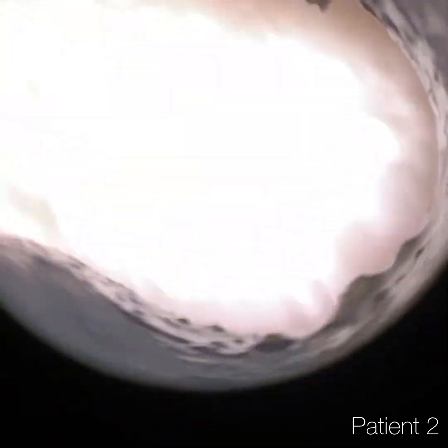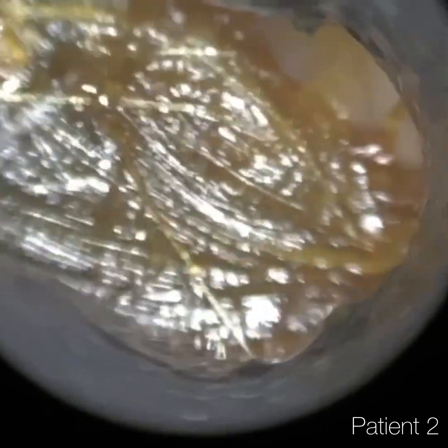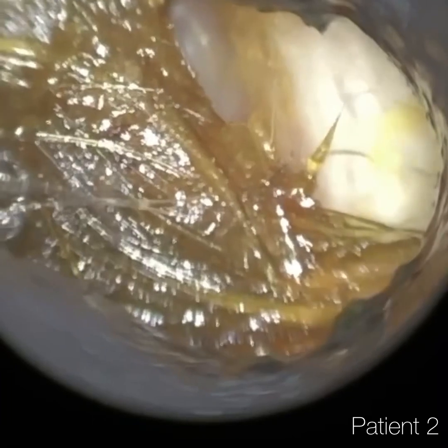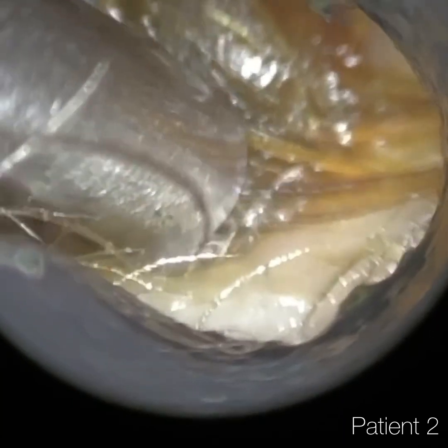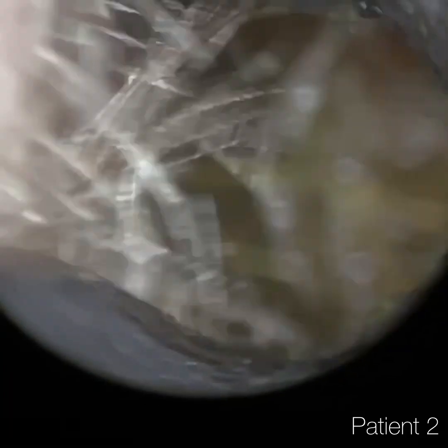The patient did have quite a bendy and narrow ear canal. And that's where I think the Waxscope will help delegates who struggle with the iClearScope — the dexterity needed, the bilateral integration. So this is the patient's right ear, and similarly, there's quite a few hairs that have matted. Loads of keratin involved with this wax plug. It's quite glossy. I think I'm going to use an ear hook now.